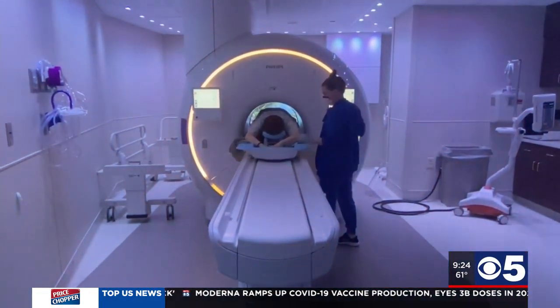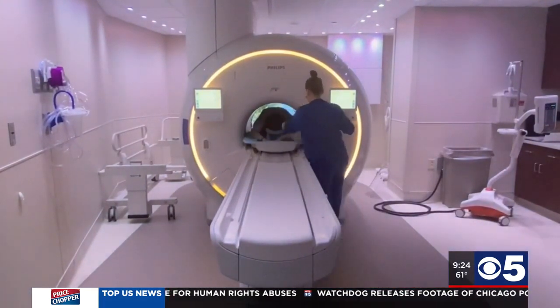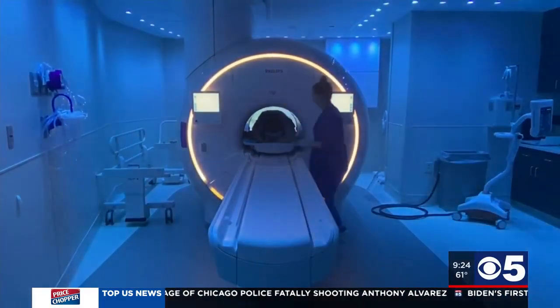And if data tells us that 1 in 8 women will be diagnosed with breast cancer in their lifetime, I mean, that's one person at a dinner table. Who should be getting the Fast Breast MRI? The Fast Breast MRI is geared towards women at average risk and those with dense breast tissue. So women at high risk should continue getting the traditional breast MRIs.